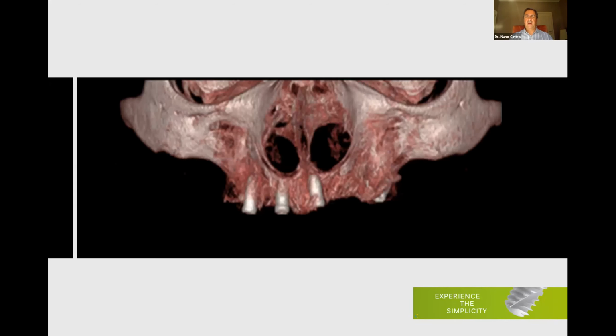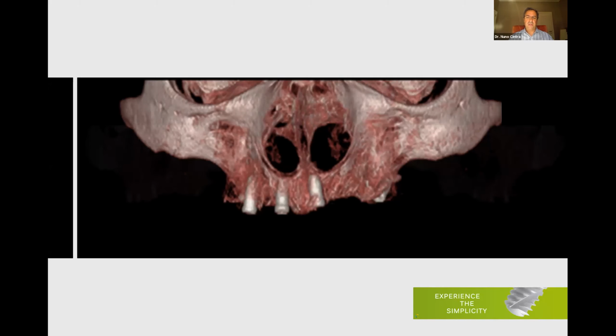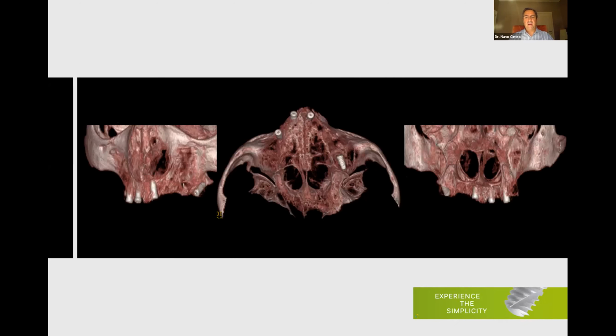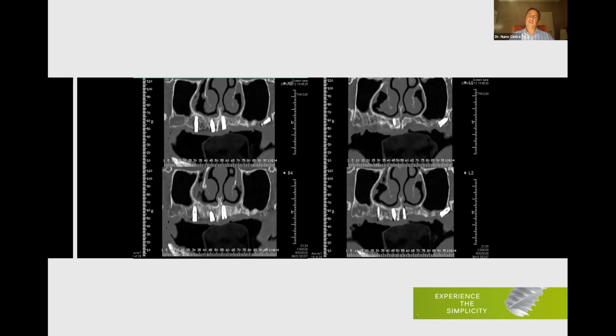Situations like this. I got this patient from a colleague. I cannot understand the position of these implants. As you can see, the patient has 3 implants with some bone resorption already, and 1 implant in the tuberosity in such a way that it was not possible to use it. So we decided to remove everything and redo everything again, because on the CT scan, we can see that we still have enough bone structure to do a standard all-on-four even after removing all these implants. So that's what we did.